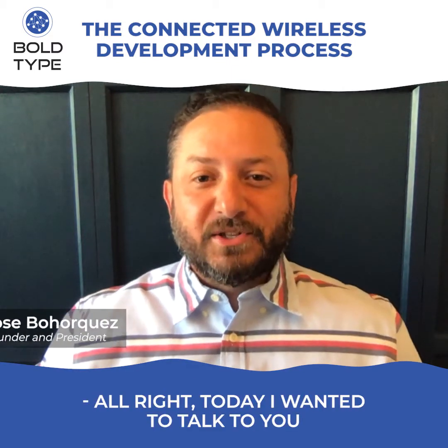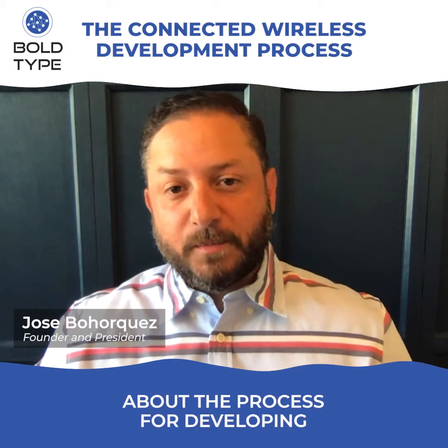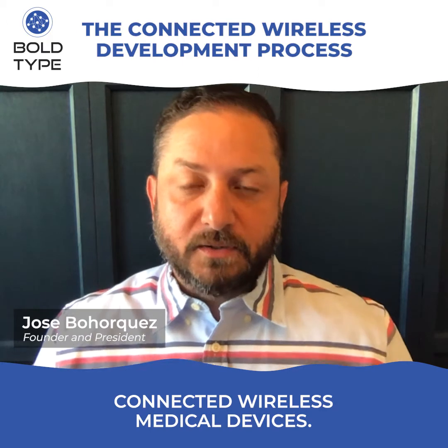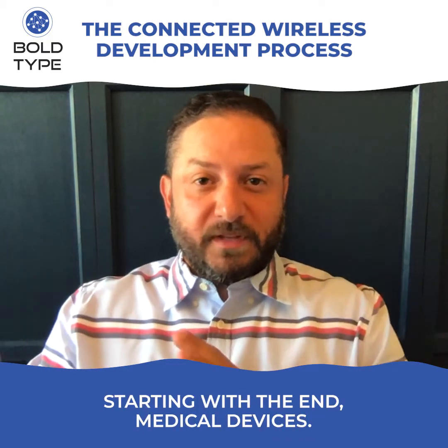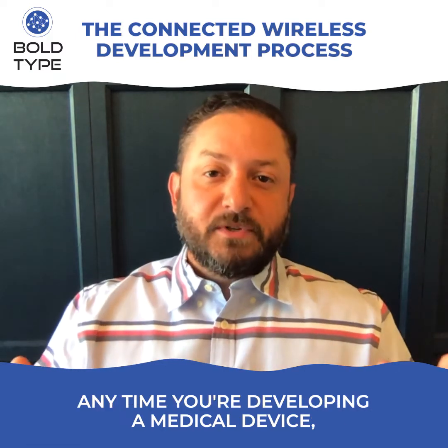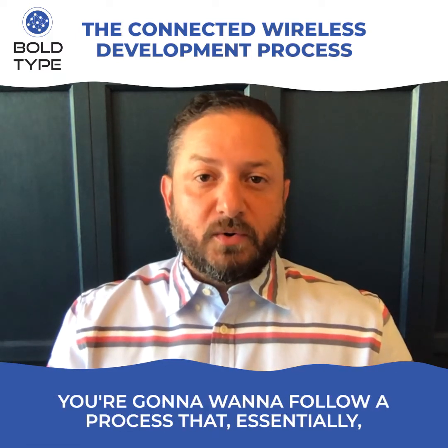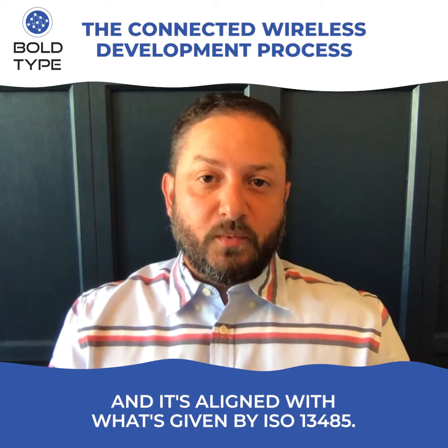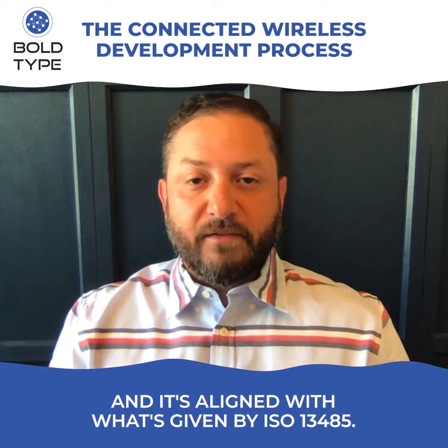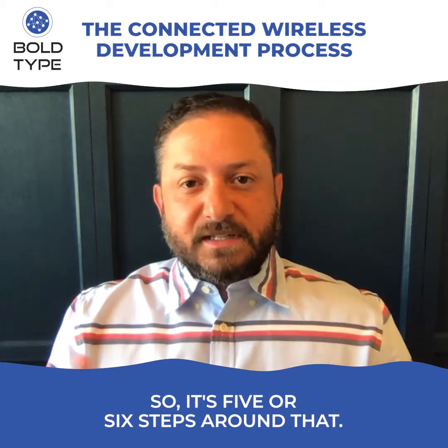Hi, today I wanted to talk to you about the process for developing connected wireless medical devices. So let's take it one term at a time, starting with the end, medical devices. Anytime you're developing a medical device, you're going to want to follow a process that essentially is dictated by FDA, and it's aligned with what's given by ISO 13485. So it's 5 or 6 steps around that.